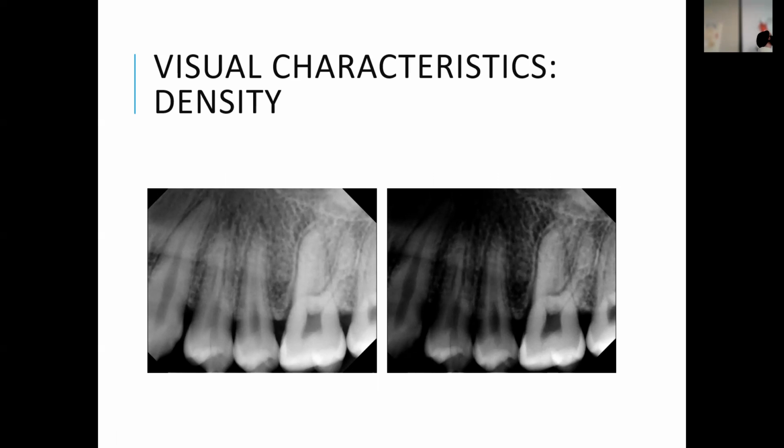So yeah, 8 inches would be more dense than 16 inches. And the reason is because of that inverse square law.